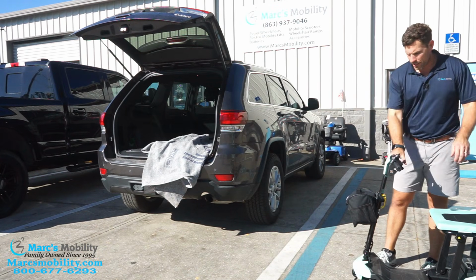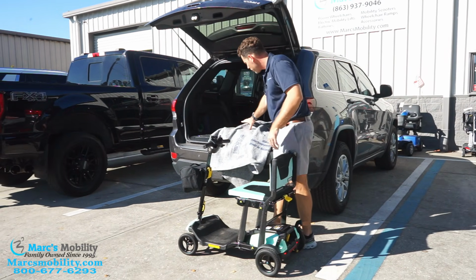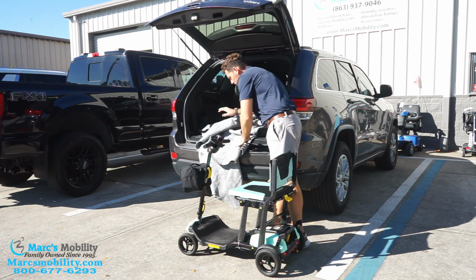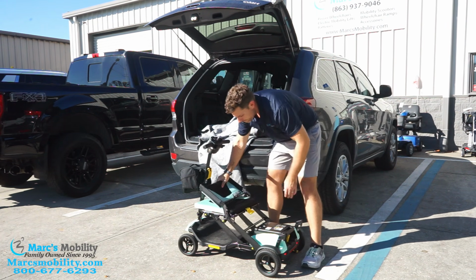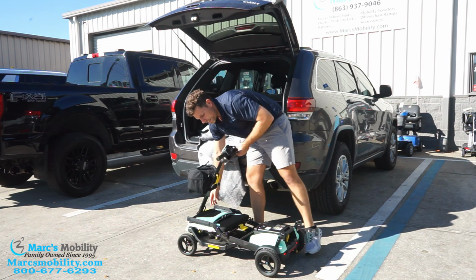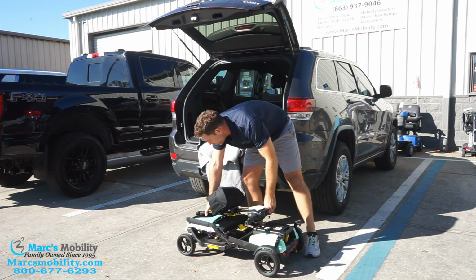All right, so what you would do here to load this in the back of the vehicle is I do recommend carrying a blanket like this with you on the back so that you can put it somewhere over the rear bumper so that you don't have to worry about scratching up the back of your vehicle. Now from here, same thing as we showed you earlier in the video, put that tab, fold it forward. You're going to pull this yellow handle here till this pulls all the way down, and then this is going to lock back in place.